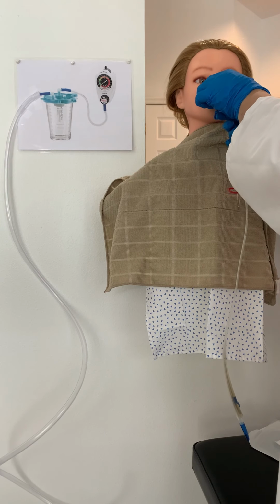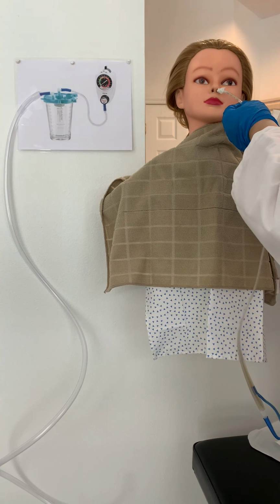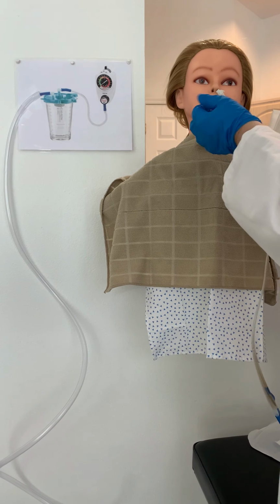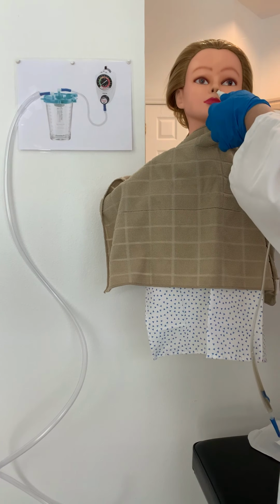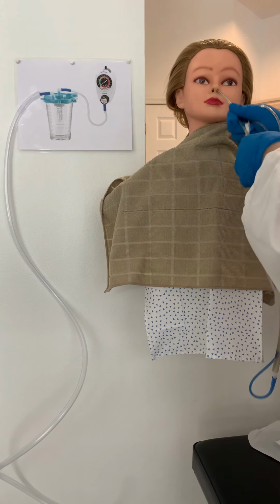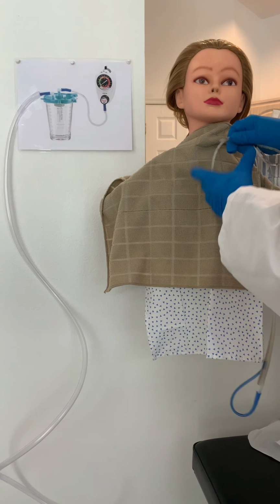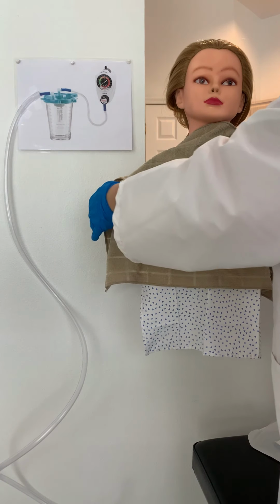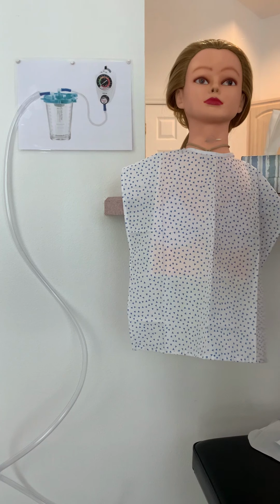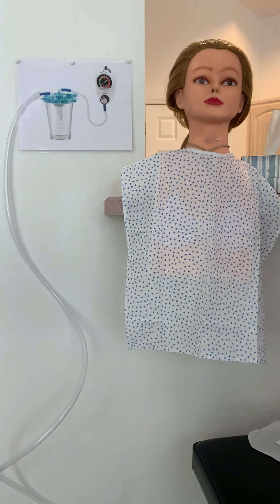Okay, so on the count of 3, Mrs. Harper, I'm going to have you take a deep breath and hold it while I pull this out. All right, 1, 2, 3. Deep breath, hold it, hold it. All right, good. And we can just wrap this in that towel and throw the tubing away.